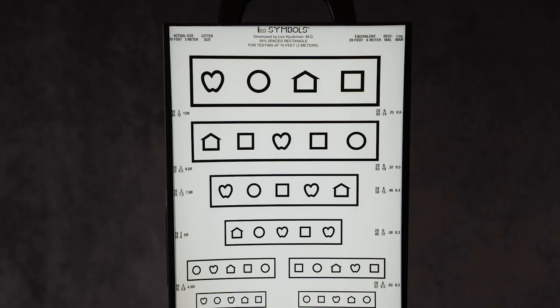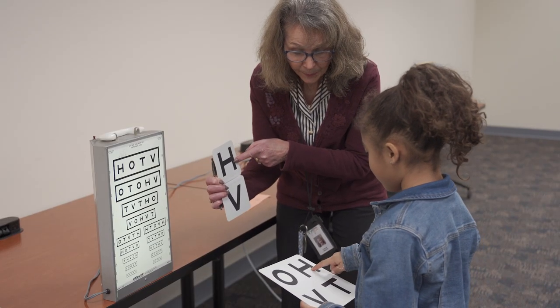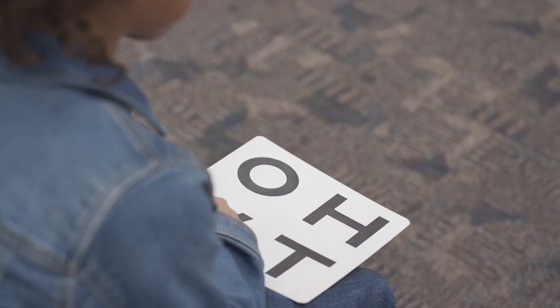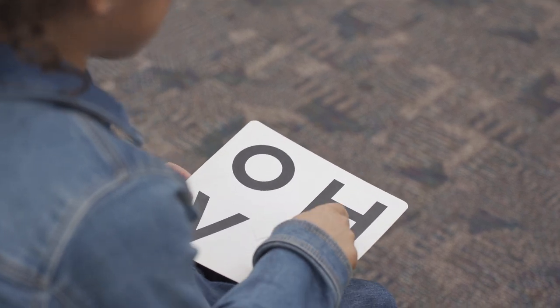When using the LEA chart, please note that it does not matter what the student names each shape as long as they are consistent. For example, a shape can be called a heart or an apple, but as long as the student calls it the same thing every time, it does not matter. Practice the matching game with the student close to the chart, then have them practice while they are seated. Have the student hold the matching chart in their lap so you can see where they are pointing.